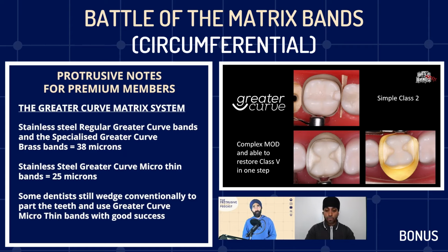And what if I was to use a wedge with a standard? Do you think that almost reduces the efficacy of it? Yeah, certainly. Again, the reason this technique was even born, Dr. Brown came up with this, was the variability in results. We've all had it where we've done restorations, followed our protocols, and yet the contact was light, or we do an MOD and one side was light and one side was heavy.